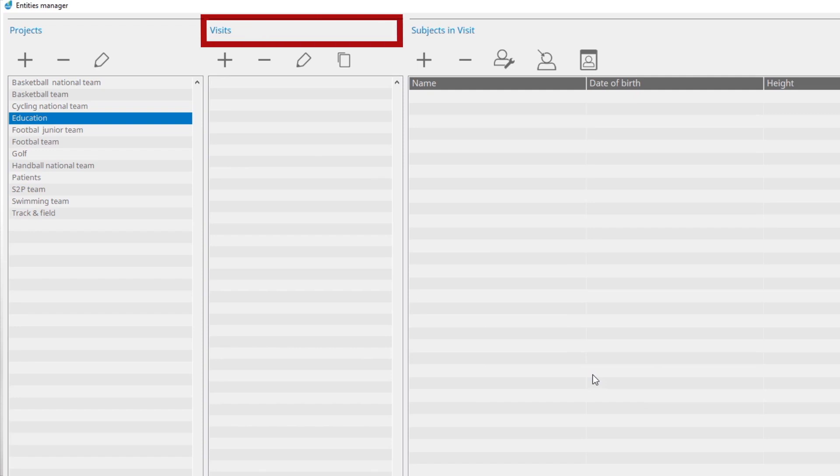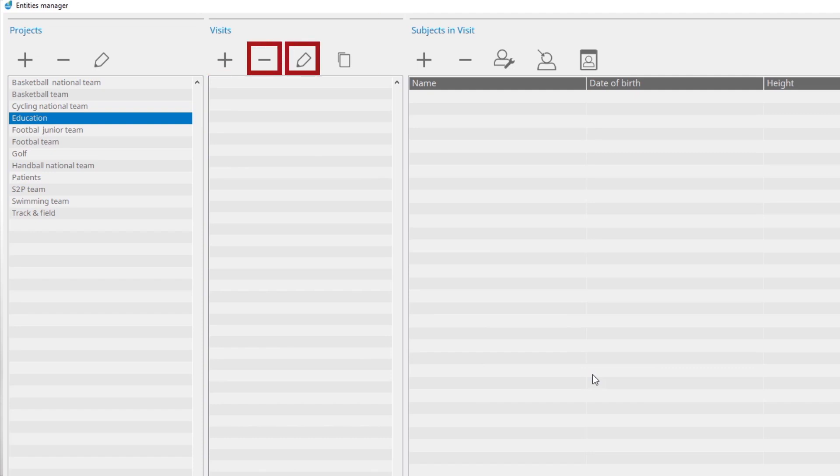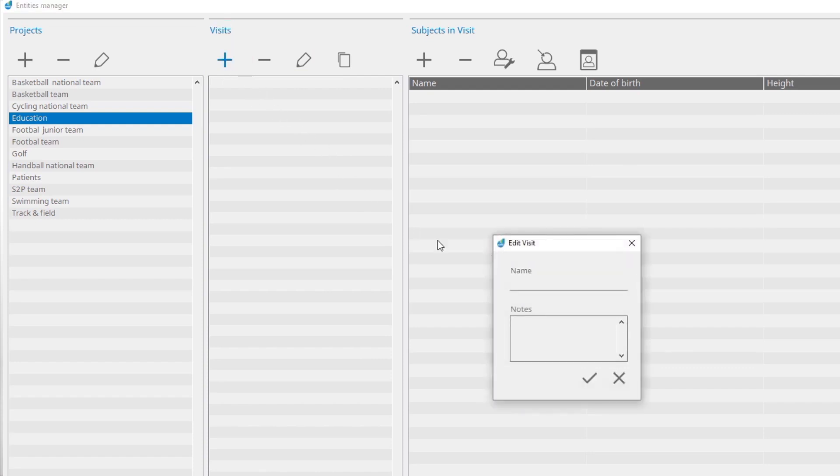Above are buttons to create new visits and to edit and delete existing visits. With the Add button, create a new visit. Write a name for the visit. If necessary, you can add notes.